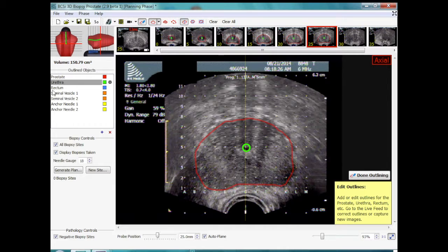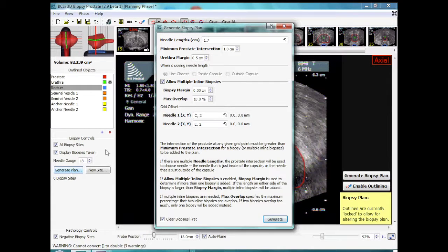Now the urethra is being added. In the biopsy generate plan, various options are available including length of needle core, distance from capsule to the first needle, distance from the urethral margin to the needle, and overlapping needles.